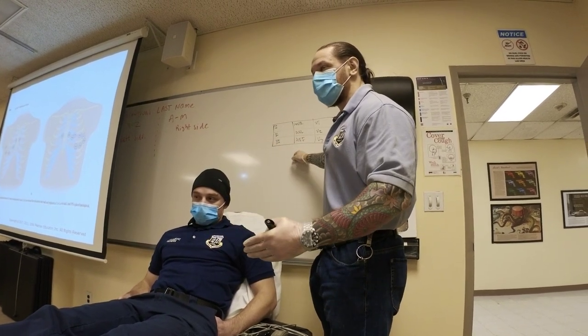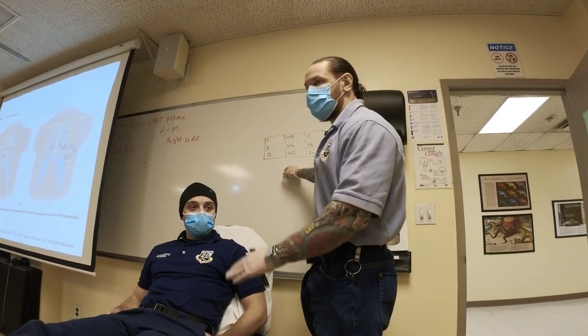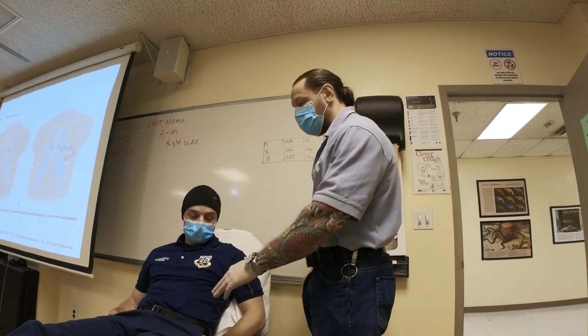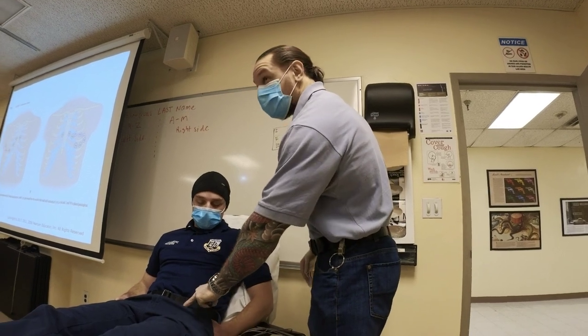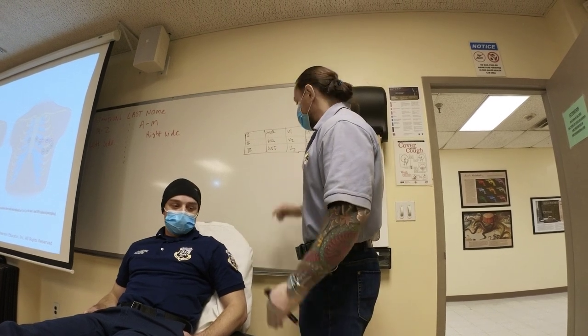So let's say you just needed a three lead strip. You can put them anywhere. But the moment you decide to do a 12 lead, make sure you move them off the torso. So it has to be below the shoulder and below the inguinal ligament. So anywhere on the leg, below the shoulder. Make sense? So this is why we do this.